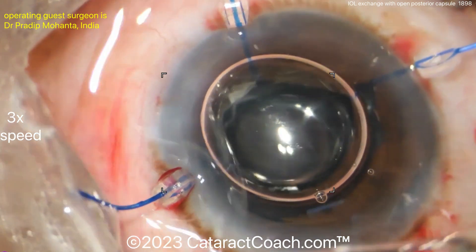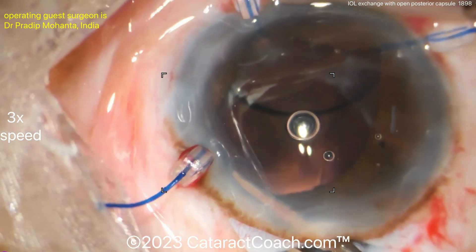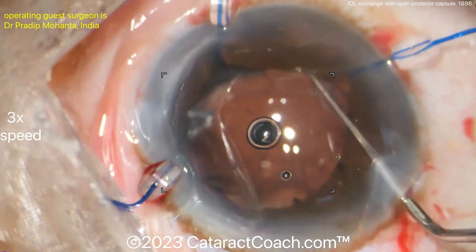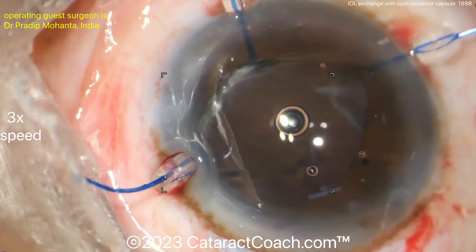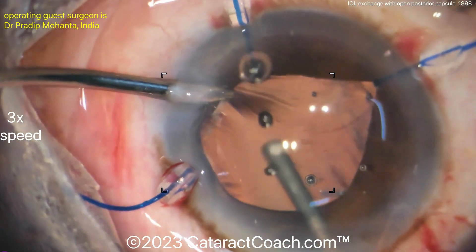Sulcus placement provides very nice long-term stability, especially if you can achieve optic capture through the rhexis. The lens is centering up nicely. Then clean up the remaining viscoelastic from the eye — and consider a little more anterior vitrectomy if needed. More triamcinolone can certainly be used to check for remaining vitreous.